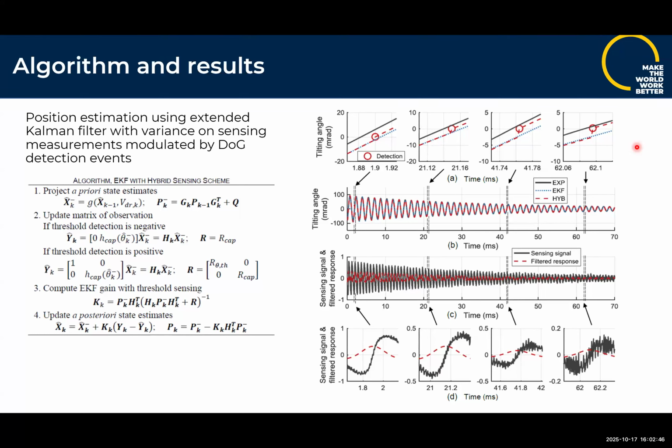Most of the time you have your imperfect model running an estimate of the states of the mirror, position and velocity versus time, based on that really noisy sensing signal. Then the derivative of Gaussian signal senses an occasional update that we crossed a high confidence point at this time, and you insert an essentially well-known state estimate with very low variance at that instant. And it actually helps quite a bit.